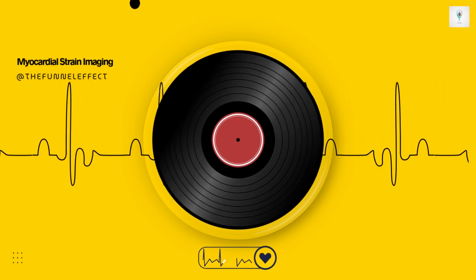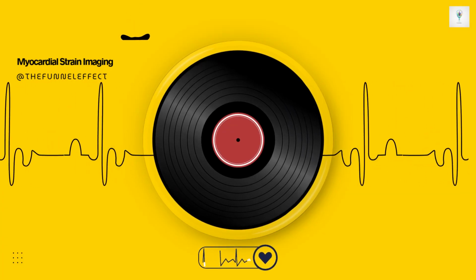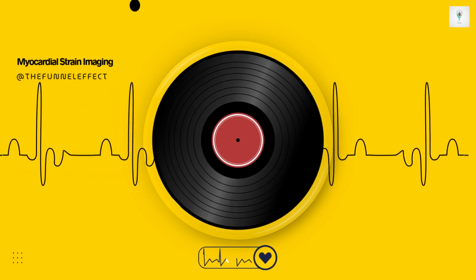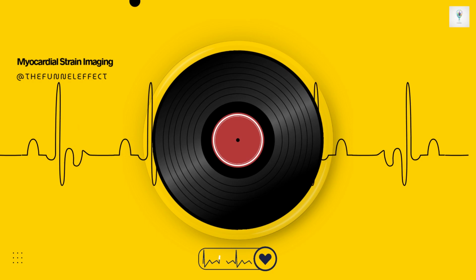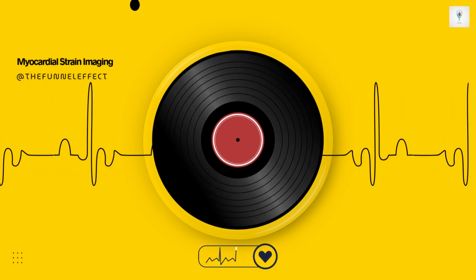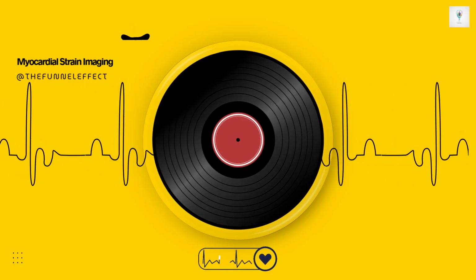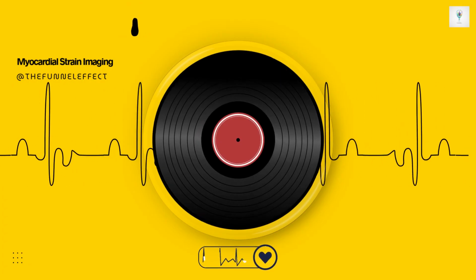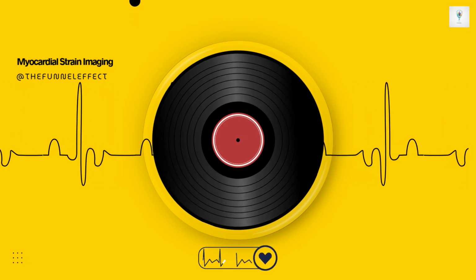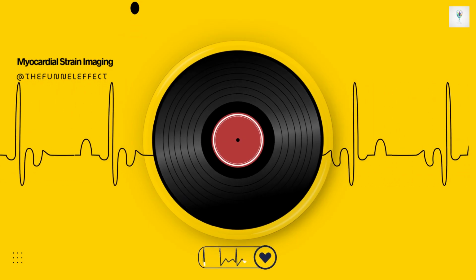Okay, GLS gives us a fantastic window into LV systolic function, but the review pushes beyond that towards understanding the heart's energy use and the function of the other chambers too. Let's start with the myocardial work index. This sounds like where we really get into the heart's efficiency. Yes, the myocardial work index is a really exciting, relatively recent, non-invasive approach. It cleverly combines two pieces of information, the LV strain we've been measuring, which represents deformation, with a non-invasive estimate of the pressure inside the left ventricle during contraction.